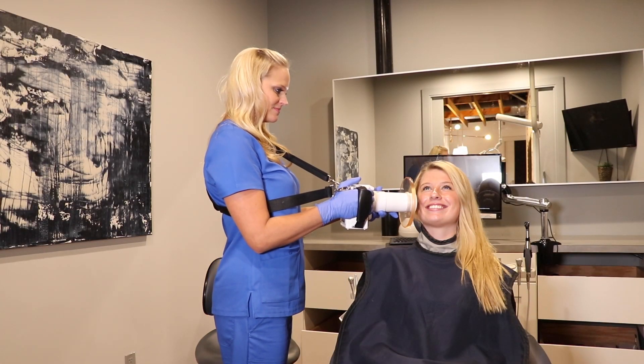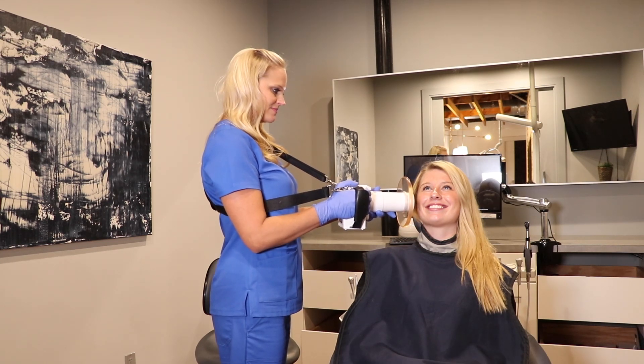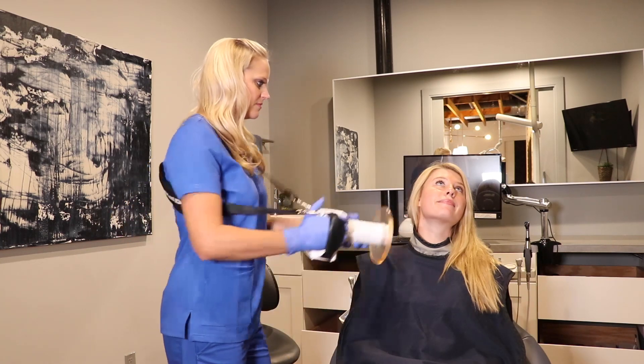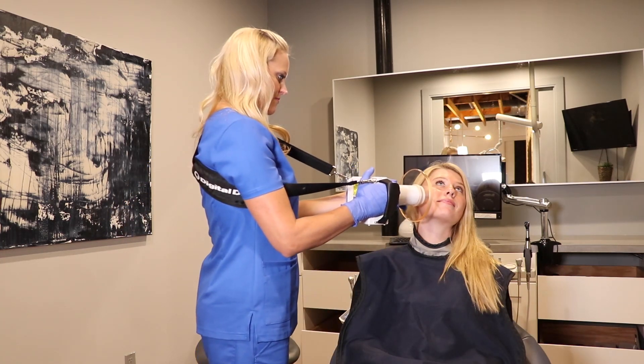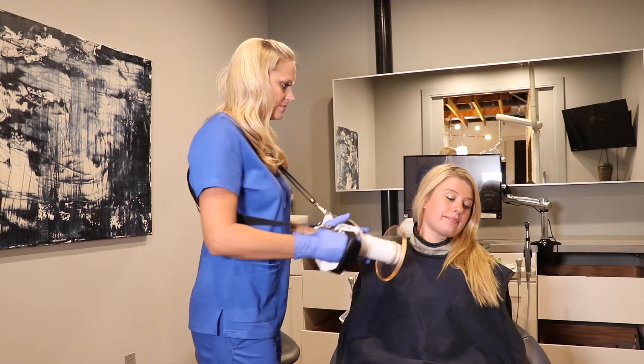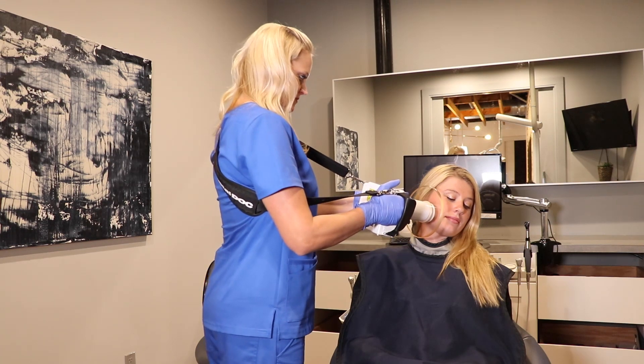For the bite wing image, just keep your patient looking straight ahead. These next two positions may be exaggerated for demonstration purposes. For the posterior mandibular PA, the patient will tilt their head up and to the side. For the posterior maxillary PA, the patient will tilt their head down and to the side.